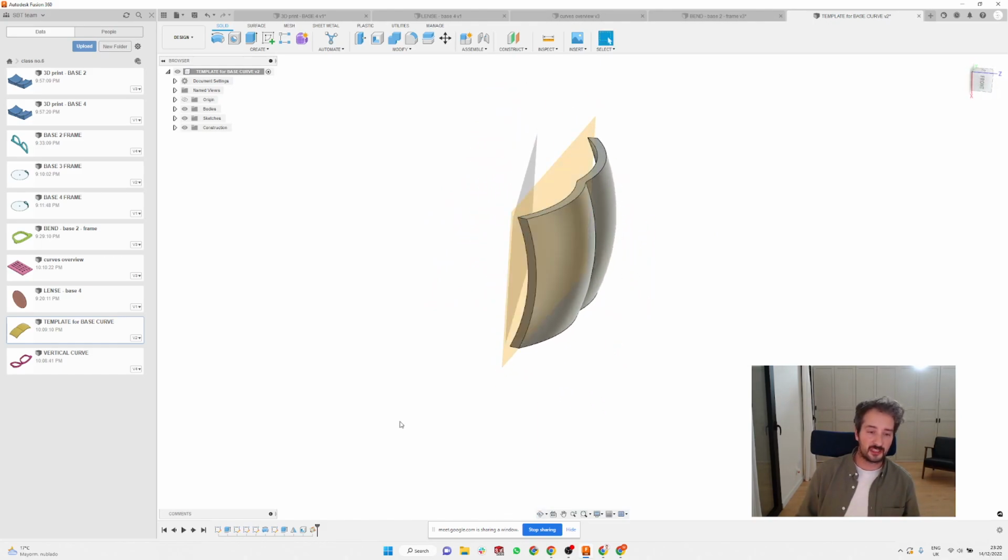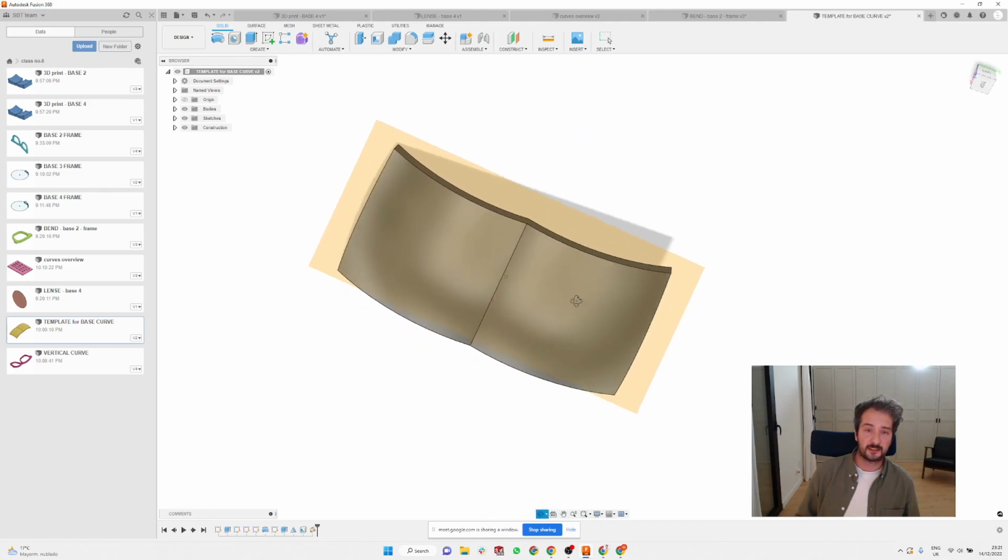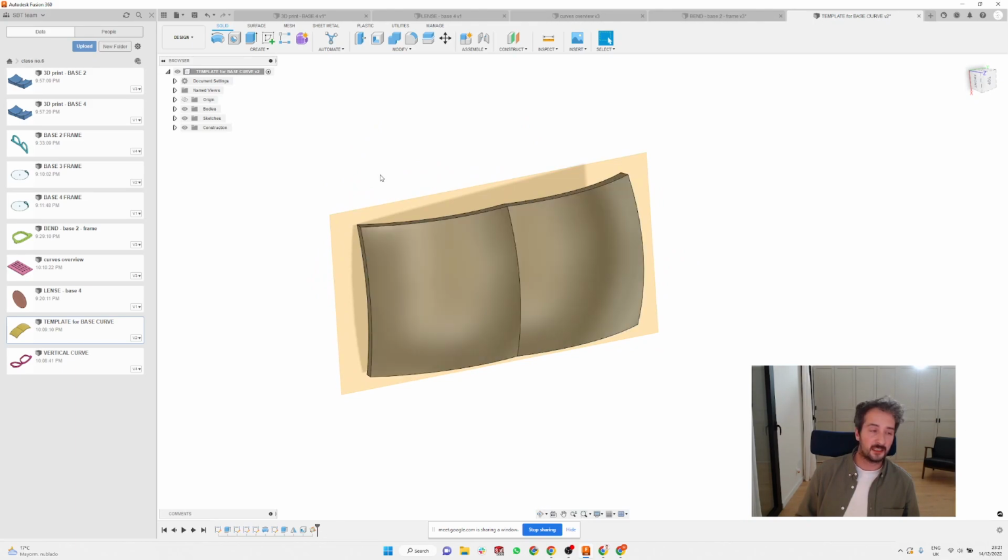I'm not gonna go through it because it's quite a lot of steps and it's a bit of an annoying process, but I'm gonna share this file with you and you can take a look at how this was done. In general, if you want to try it, you can just have this file saved at this stage, and then you can extrude any frames afterwards.